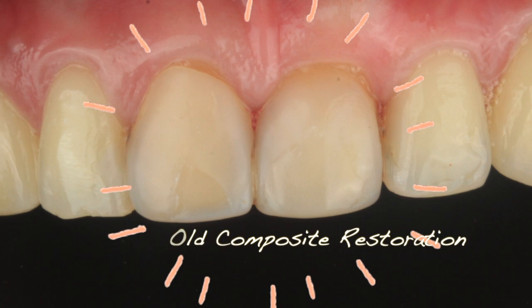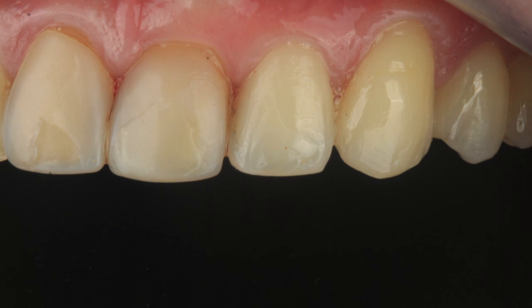So this is a 10-year-old composite restoration on the two teeth. It's clearly discolored. As you can see, may konting recession ng gums, so we have to deal with it also. Every parafunctional bite or parafunctional contact can damage the teeth. Sometimes these are the indications that we have to do something before it's too late. I've noticed that there are a lot of cavities, especially class 3 composites, which are very old and have recurrent caries, so we have to remove all the unsound structure as it will affect the condition and worsen the problem of the tooth.